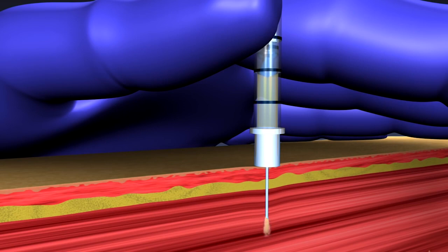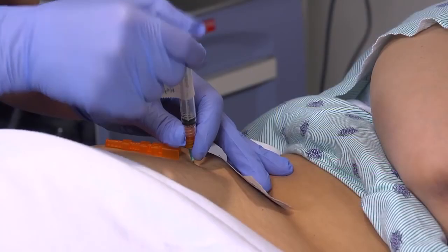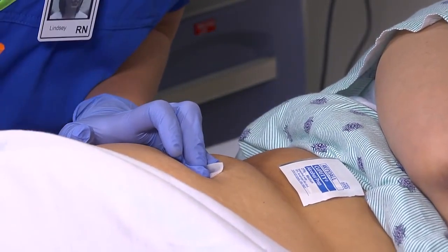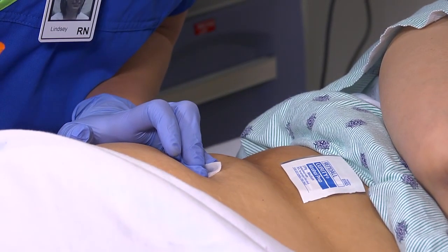Inject the medication slowly at a rate of 1 milliliter every 10 seconds. Wait 10 seconds and smoothly withdraw the needle. Engage the needle safety. Release the skin and place a gauze pad over the site. Apply gentle pressure, but don't massage the area. Apply a bandage to the puncture site if necessary.